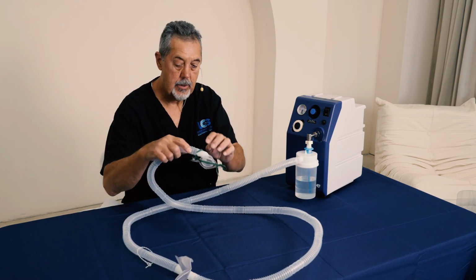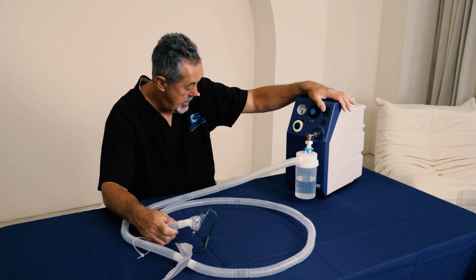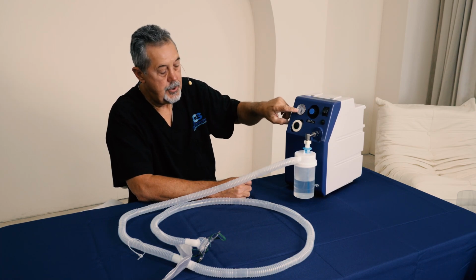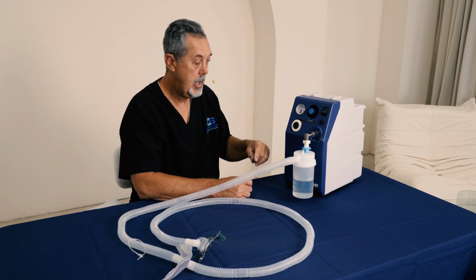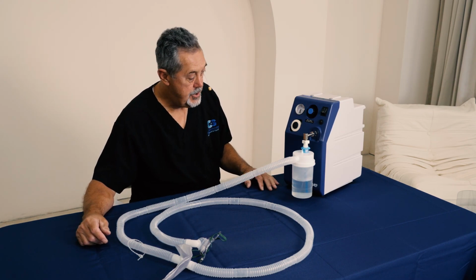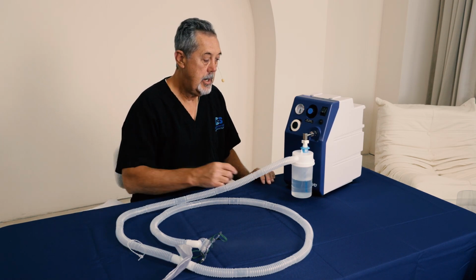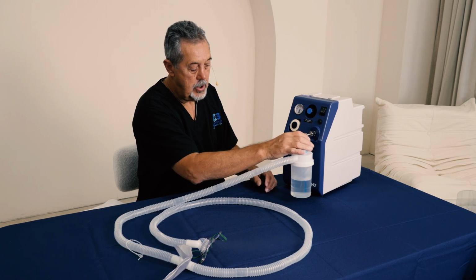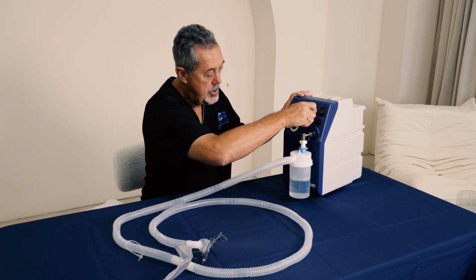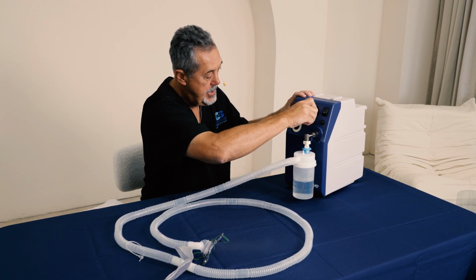Once you have it all together, you're going to turn on the device. So we're going to turn it on here. Once we turn it on, we're going to adjust the pressure on the gauge. Typically for an adult or a pediatric patient, we're going to have the pressure at around 20 to 22 psi. In order to do that, it has to be hooked up to the large volume nebulizer. You're going to pull out here, and you're going to turn the knob until you get to the desired pressure.